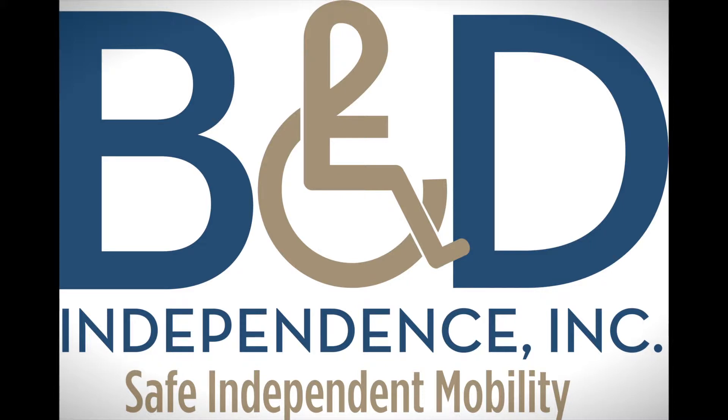Hello and welcome to the B&D Independence Online Training Academy. This is Zach Lewis, Training Manager for B&D Independence, welcoming you to the Hightower Docking Station Training Course. In this course, we will go over the proper installation, fit and function testing of the Hightower Docking Station within a minivan.